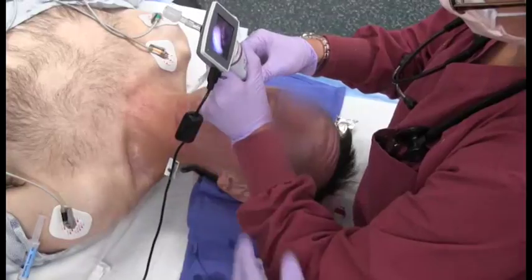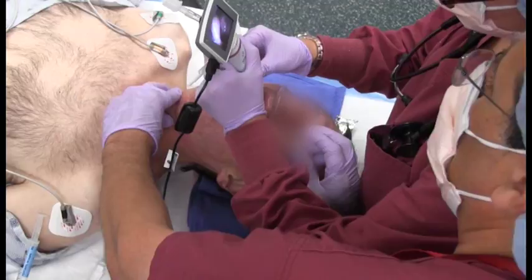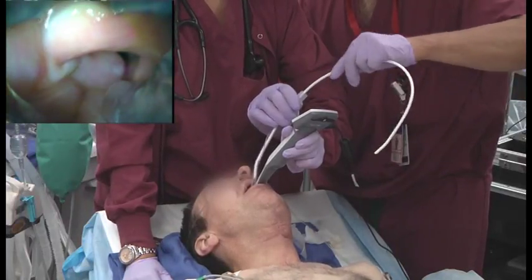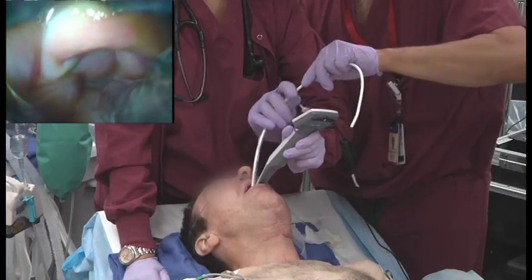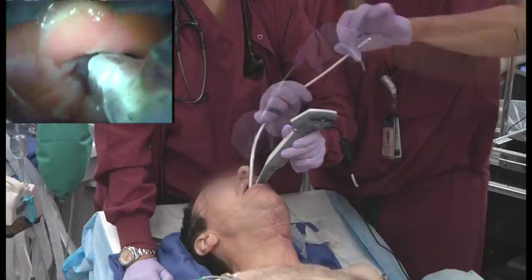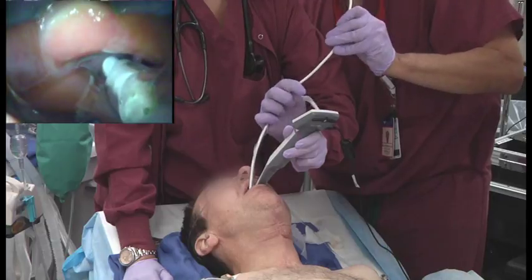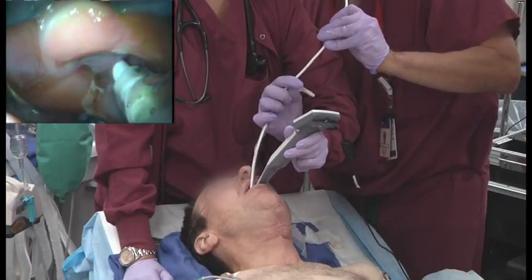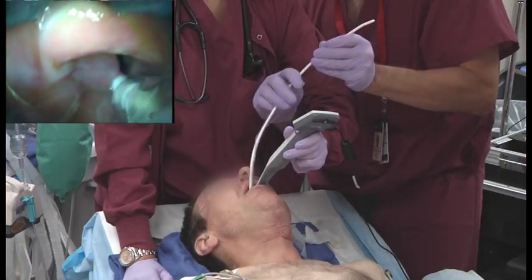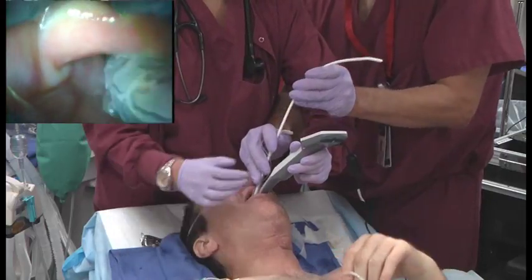The larynx comes into view, but there is difficulty aligning the tracheal tube with the larynx due to the patient's floor of mouth anatomy. A BomiMed Intros pocket bougie is being introduced via the tracheal tube. With some manual manipulation, the bougie is directed into the larynx and the tracheal tube is advanced over the bougie.